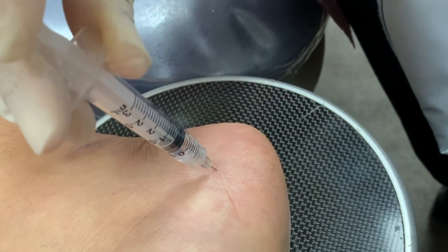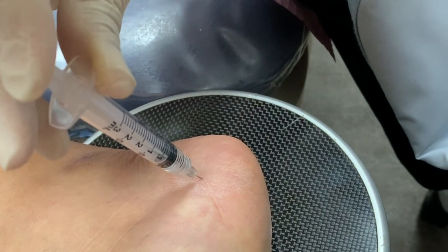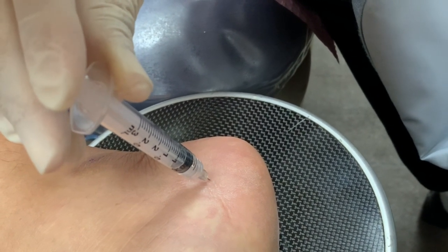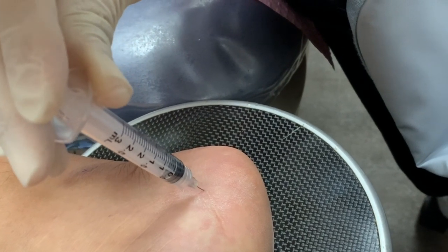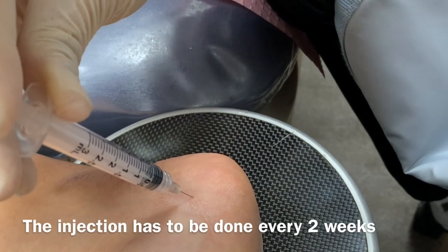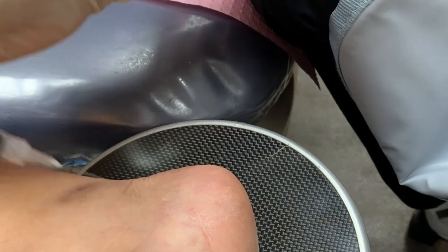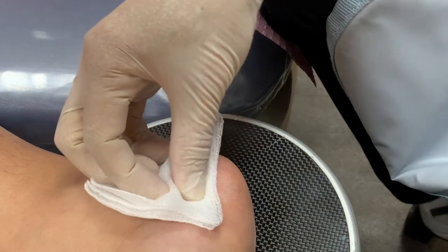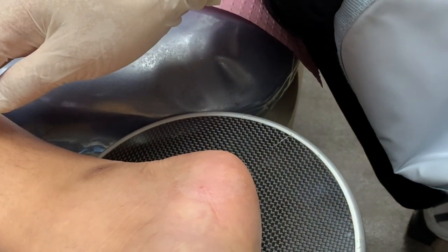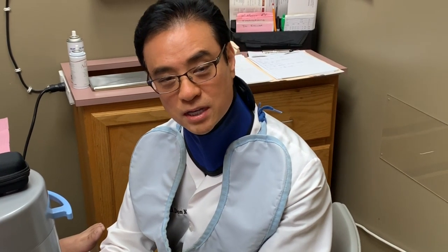After the injection, I put tape on this to immobilize the foot so that the medication doesn't spread all over the place for about 24 hours. Then they can take the tape off and go back into their orthotics and their activities. This injection is done every two weeks, and I tell them to take it easy after the injection for about two days because we want the medication to stay in that area to work — staying off their feet and avoiding a lot of standing and walking.